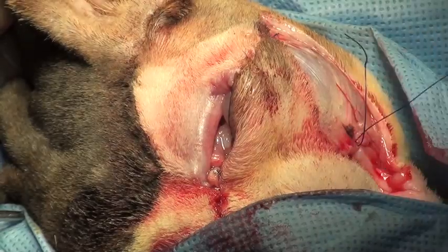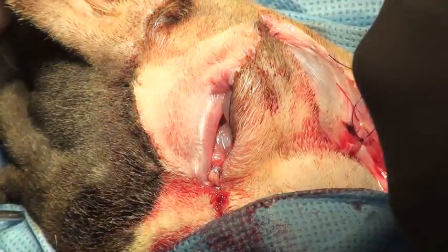The defect in the oral mucosa is reconstructed using a simple continuous suture pattern.